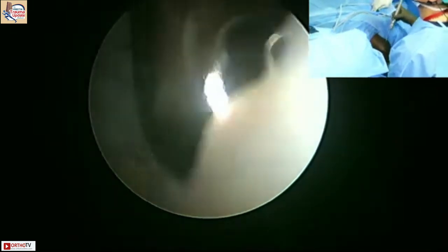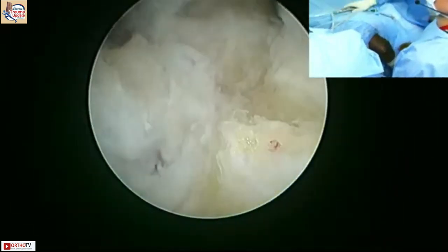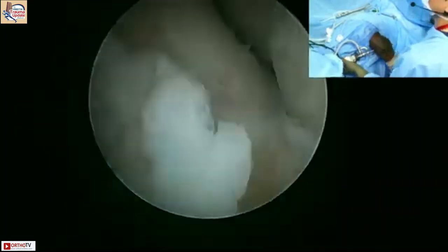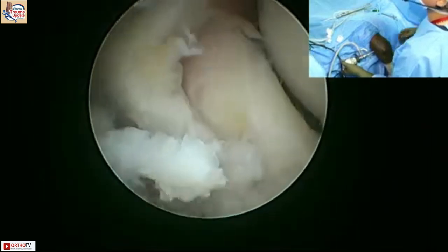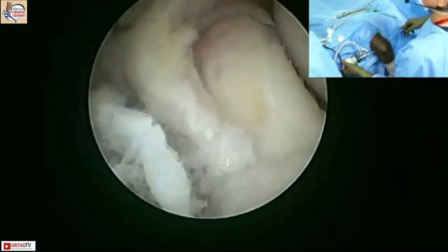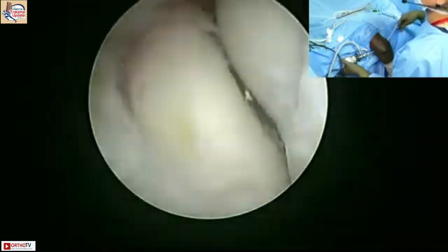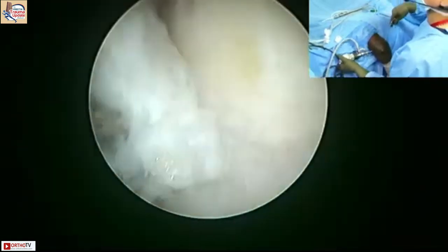So, any tips if there is bleeding and a bloody field, what tips do you have? Say again? If there is a bloody field, then I think you cannot do arthroscopy with a bloody field. Give me a grasper, please. So I think you should know when to stop. Yeah. Stop. Go open. Do as little harm as you can. We have got nothing to prove to anybody. True. True.